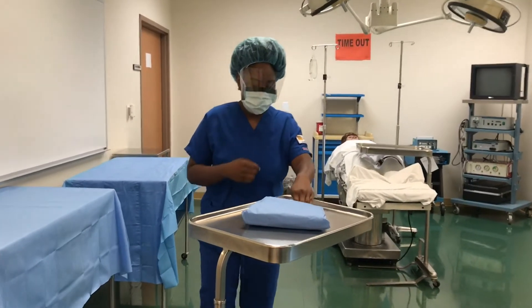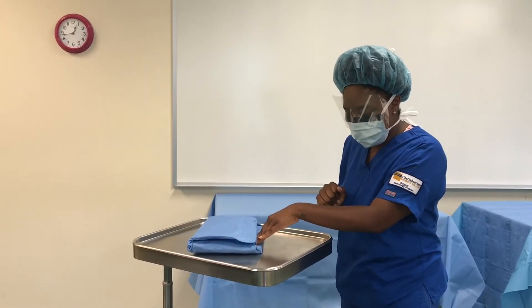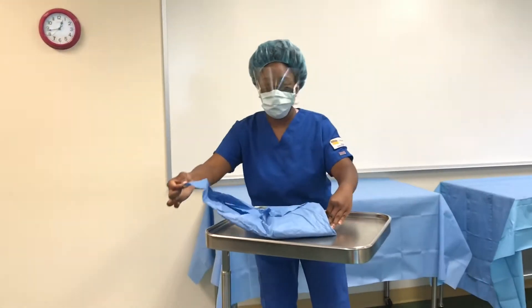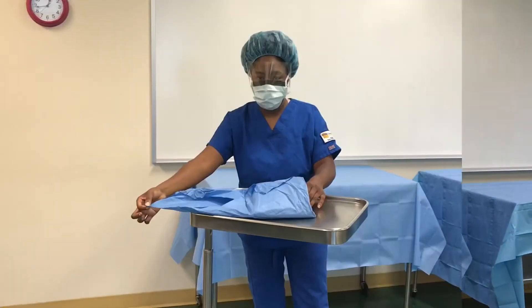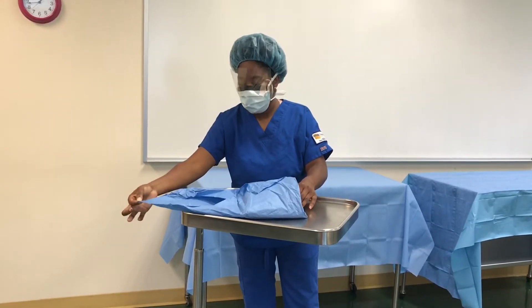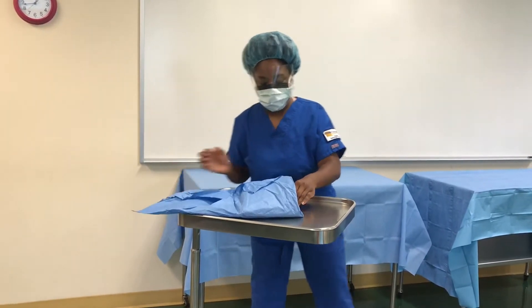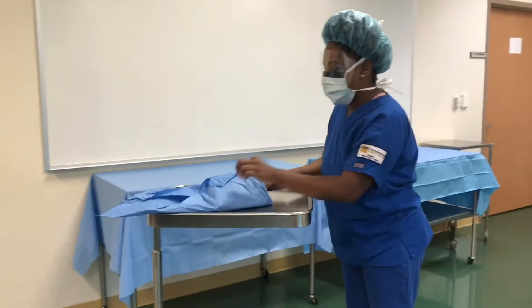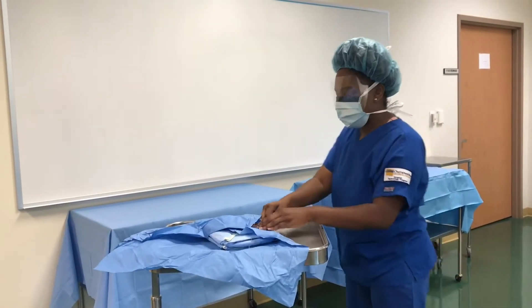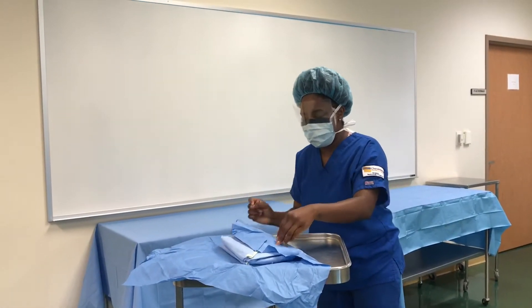I'm going to put my hand right here on the opening of the gown. You want to come to the side — you don't want to reach over it. Stay within the one-inch mark; anything past one inch means you have contaminated it. So I come to the other side and bring this over, open it up from this corner, and then open it from this corner.